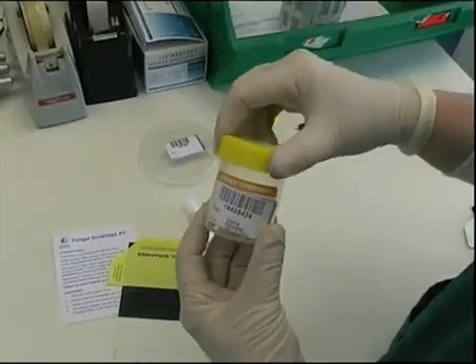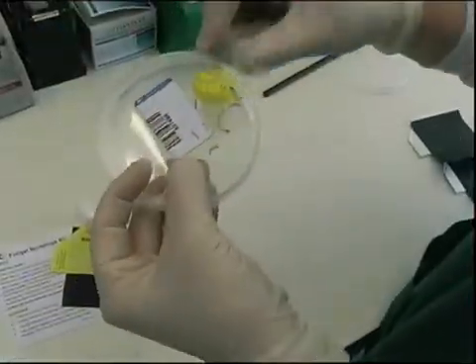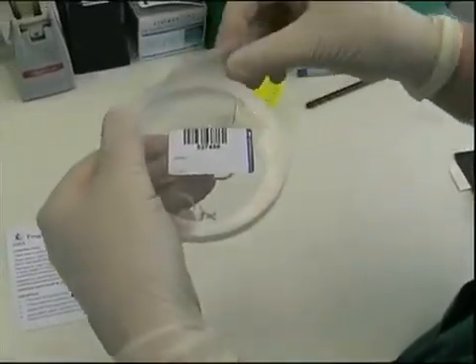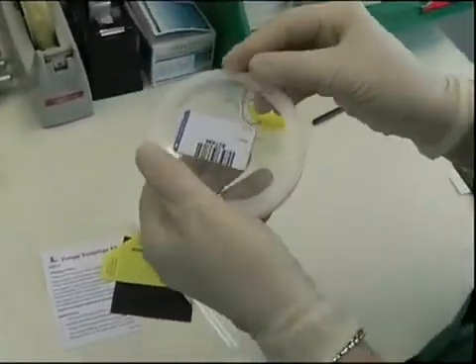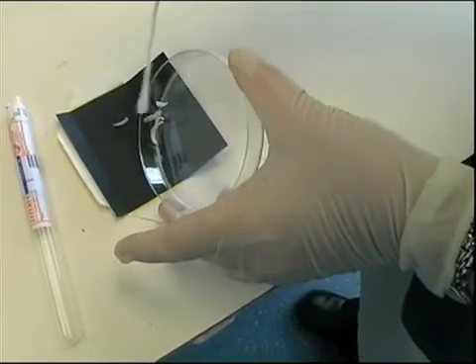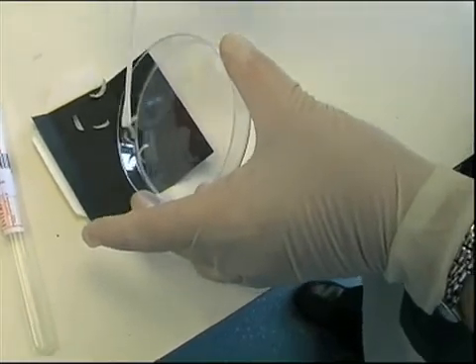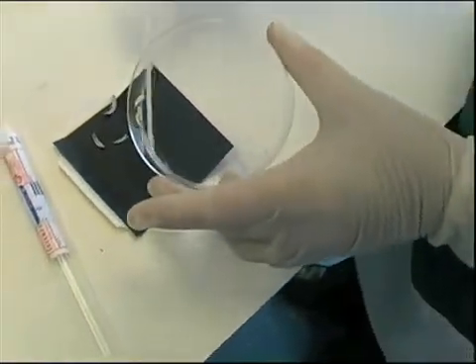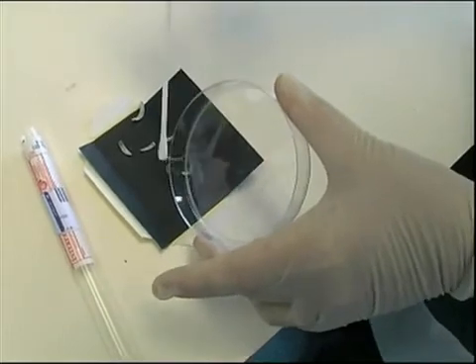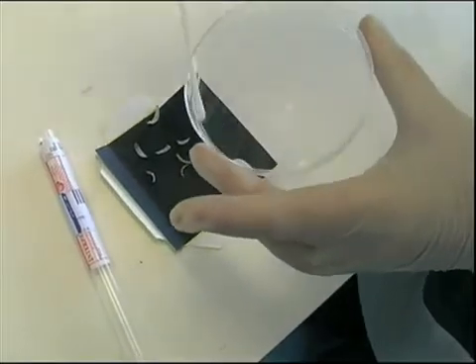Nail specimens may also be collected into plastic universal containers or into plastic petri dishes. If a plastic petri dish has been used to collect the specimen, it should be carefully sealed using parafilm. Sticky tape should never be used to seal petri dishes. The only reason for transferring a specimen from a plastic container to a black card would be for transport via the mail. This is often a difficult process due to the electrostatic charge associated with plastic containers. Use a swab to help sweep the specimen onto the card and to pick up any small bits. When finished, also send the swab to the laboratory.